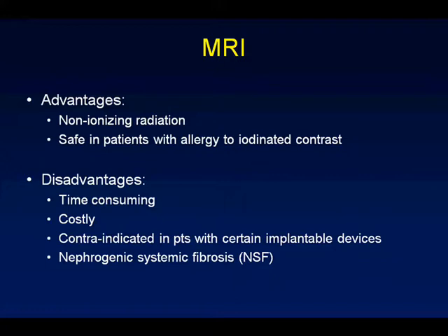Silvia, sorry. Yes? Current status of pregnancy? Pregnancy, you can have an MRI. It's just the issue of gadolinium. We tend not to give gadolinium unless it's deemed necessary. In most cases with pregnant women, you can have the MRI and get by without gadolinium.